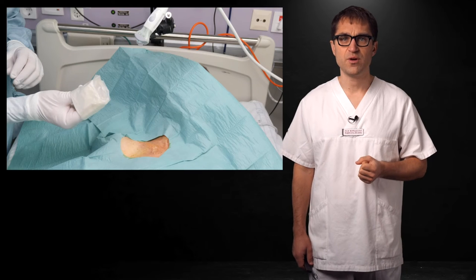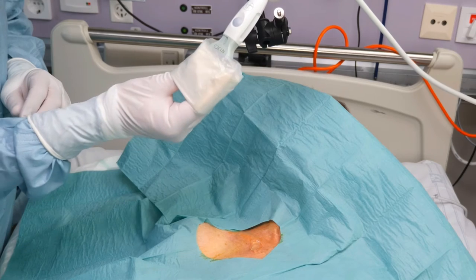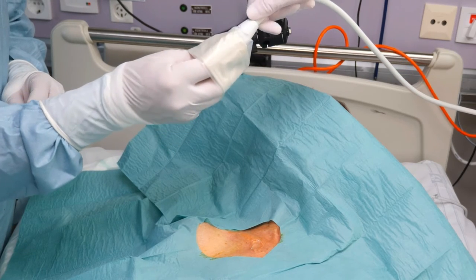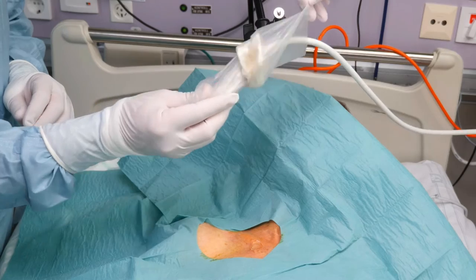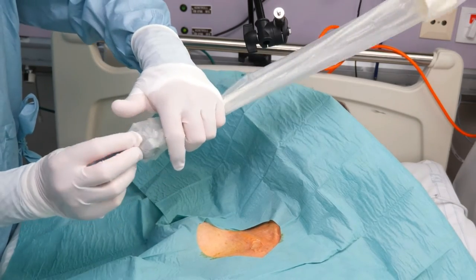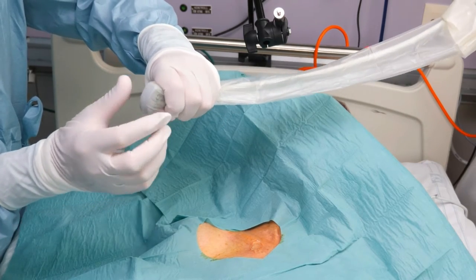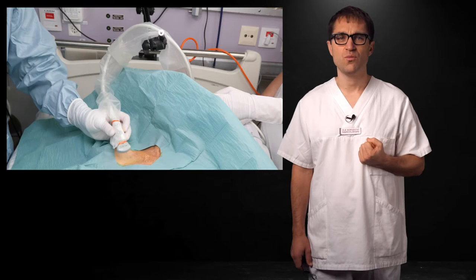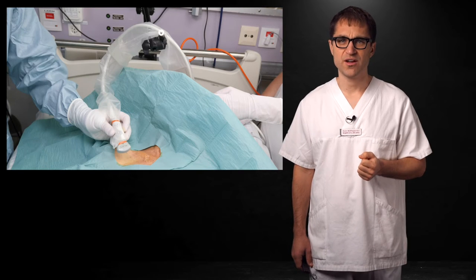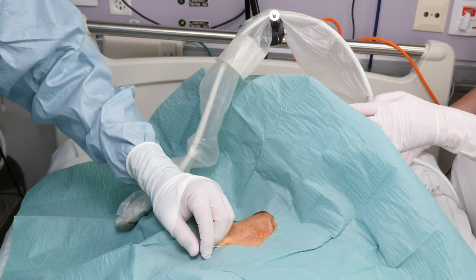This is extremely basic, but we've noticed how some colleagues are unable to get a good image of the vein due to gel being dislodged from the probe head. This is how we do it: place gel on the probe, grab the protective cover as shown, catch the probe, let the assistant pull the cover. Make sure to remove all creases from the probe head and place the elastic band without rubbing away the gel. Fold rather than pull the cover. We like to have the ultrasound cable placed on a custom hanger — it makes the whole procedure a lot easier and you can leave the probe hanging while not in use.